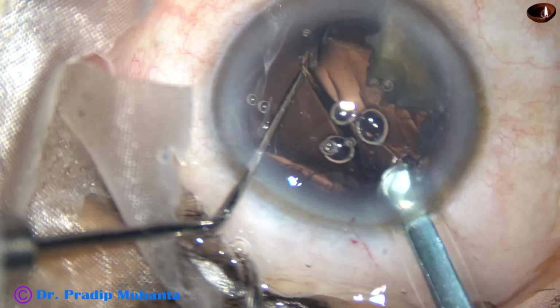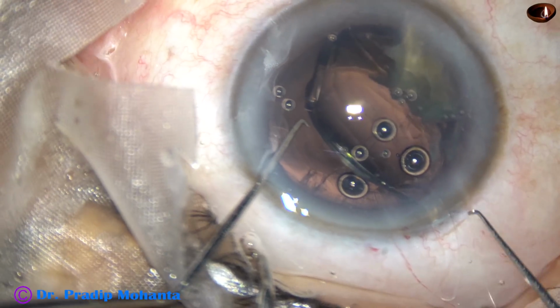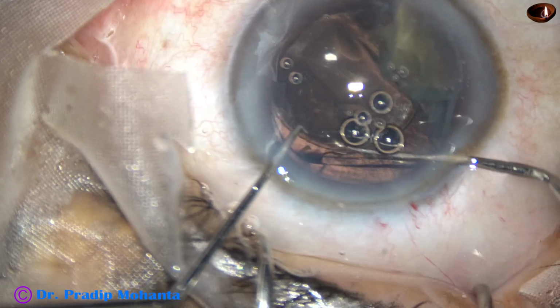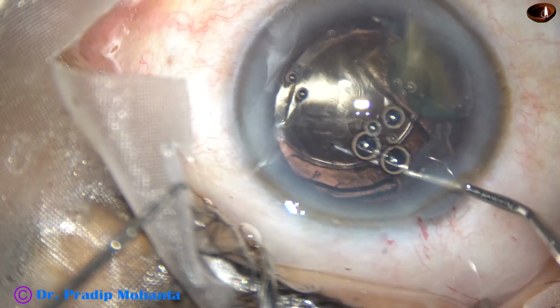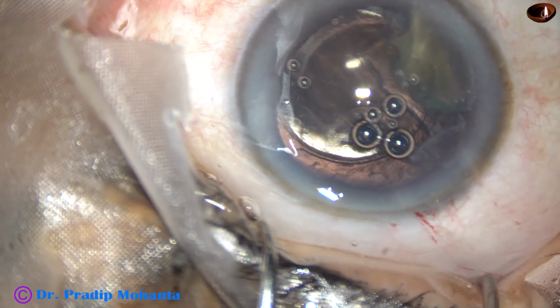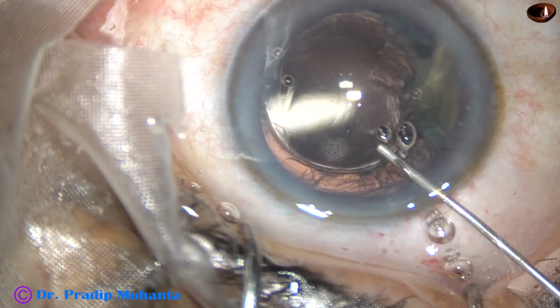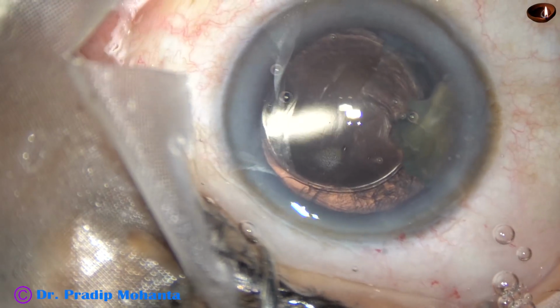The leading haptic has gone into the capsular bag, and the trailing haptic also goes into the capsular bag. Now I have a barrier between the vitreous and the anterior chamber. This IOL will act as a beautiful scaffold, and over this scaffold I can very easily emulsify this last nuclear piece.